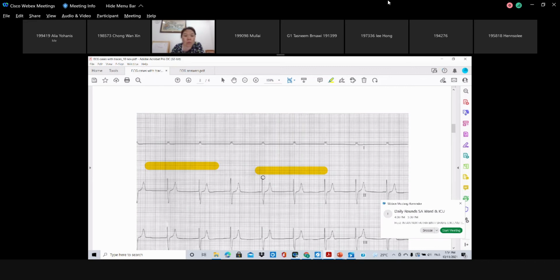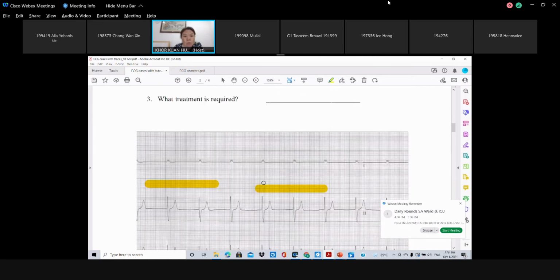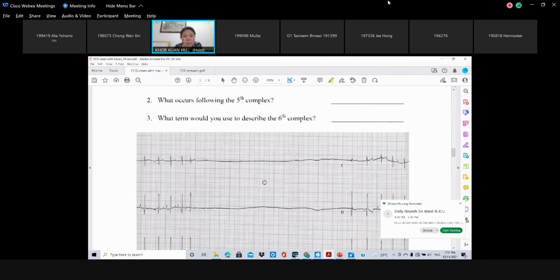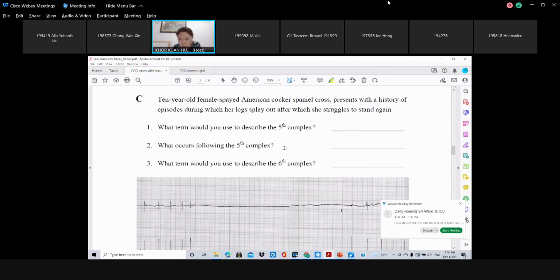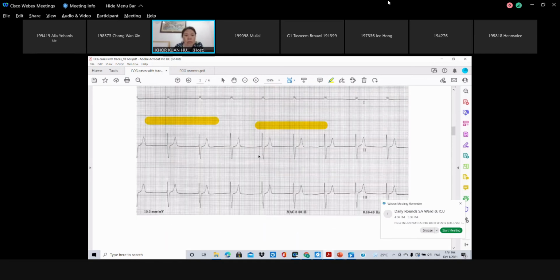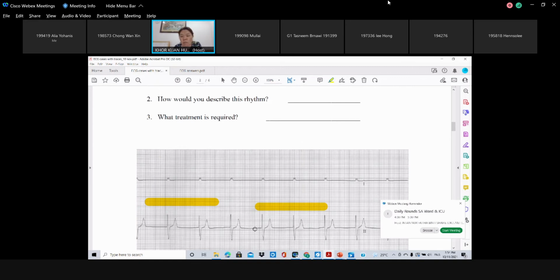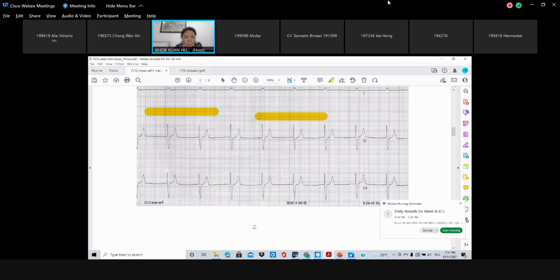Yes, atrial beat, you only calculate the P. We go further first. Just now this dog, bradycardia, will need a pacemaker. The atrial stands still. The P wave is not there.